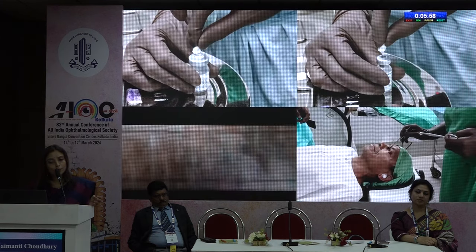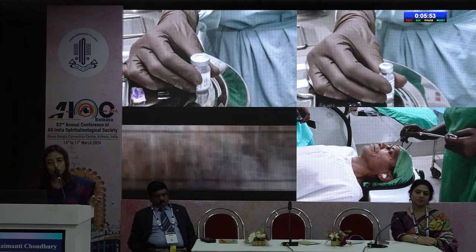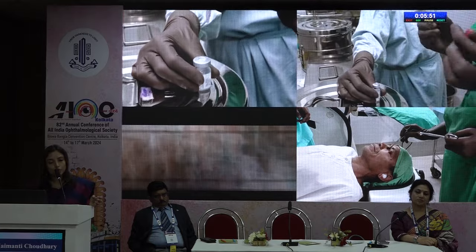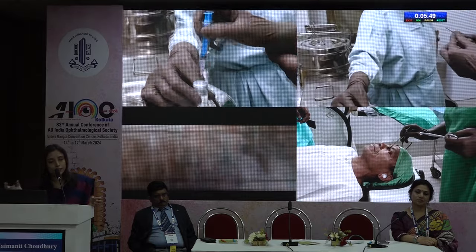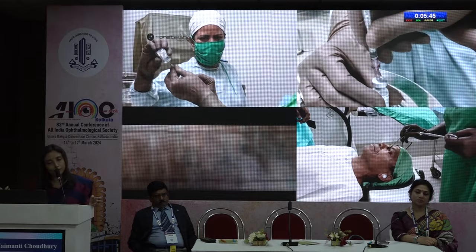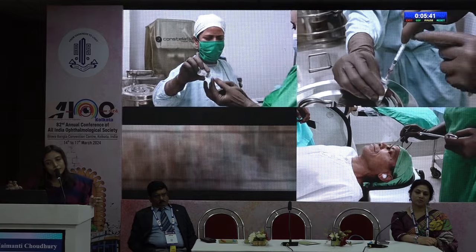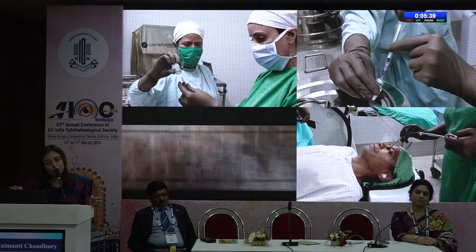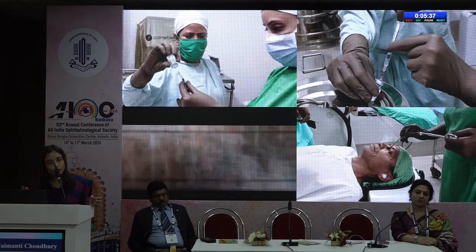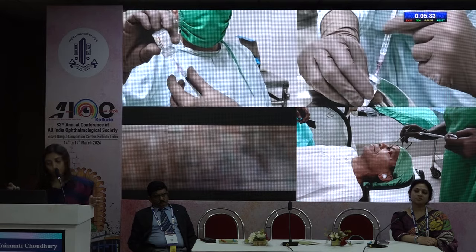Moving ahead, the box has been checked, and now the top of the vial has to be cleaned with an alcohol swab. Then taking out the medication is again different for bevacizumab and different for single use. The right-sided video is Eylea. For Eylea, there is a dedicated needle with which it has to be taken out. And for bevacizumab, of course, it is aliquoted in syringes, as I have already shown.